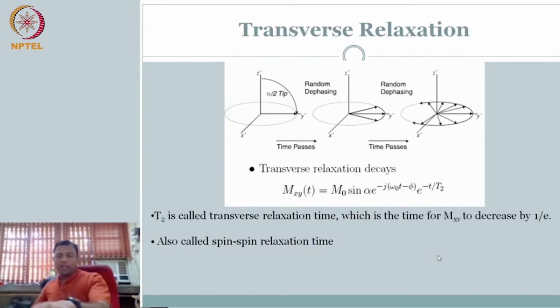Okay, we'll come to T2 star after it. Okay, this is, you got your signal. This is your Mxy, but this is not. I mean, this is just the interpretation of how do you capture this signal. That part we have not finished, but we talked about this. How do we do it?